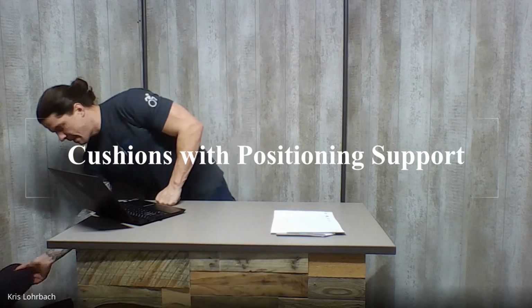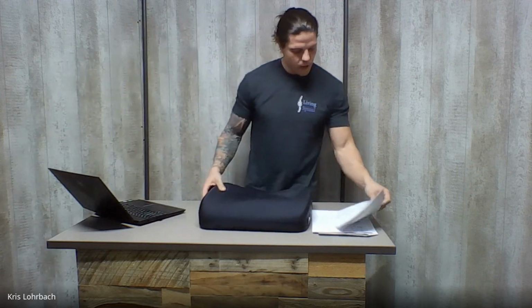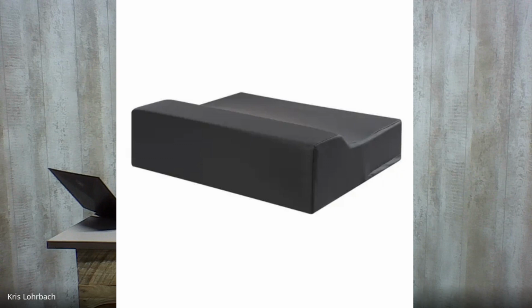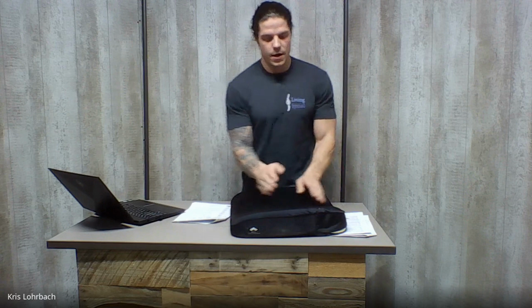There's a lot of cushions that have special support built within them. I don't even think we have any examples, but I'll go through it a little bit. You'll see a lot of words in the option sets of cushions like anti-thrust and wedge and sacral cutouts and pommel. Really all that means is that the cushion has a built-in feature that is self-correcting people's postural issues. Anti-thrust means that it's going to have some kind of a plane lowering of the rear of the cushion. Meaning it's going to take the whole cushion, let's say this is the front, this is the back, and it's going to cut it in half.